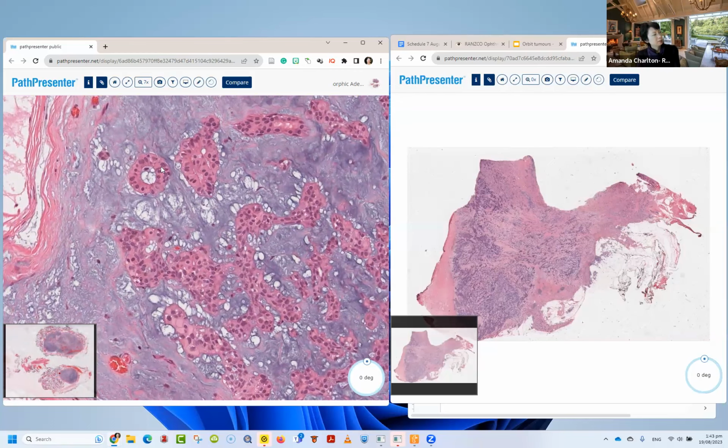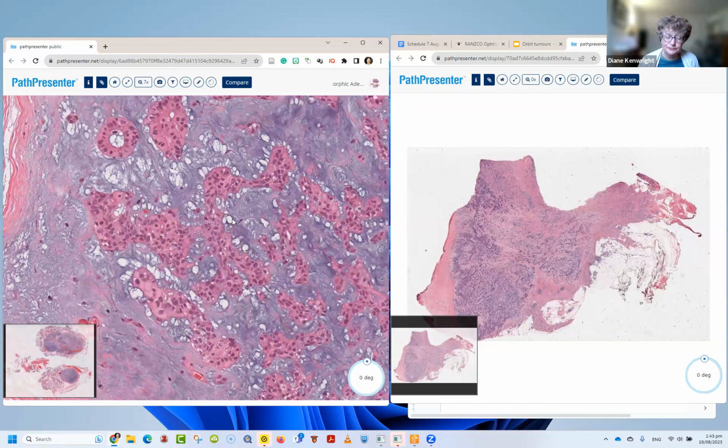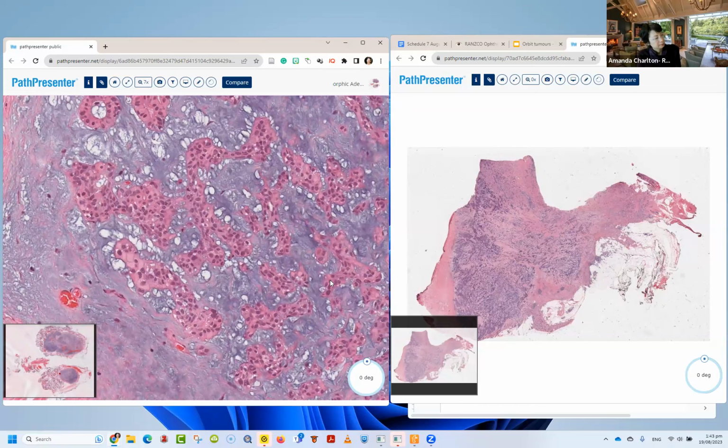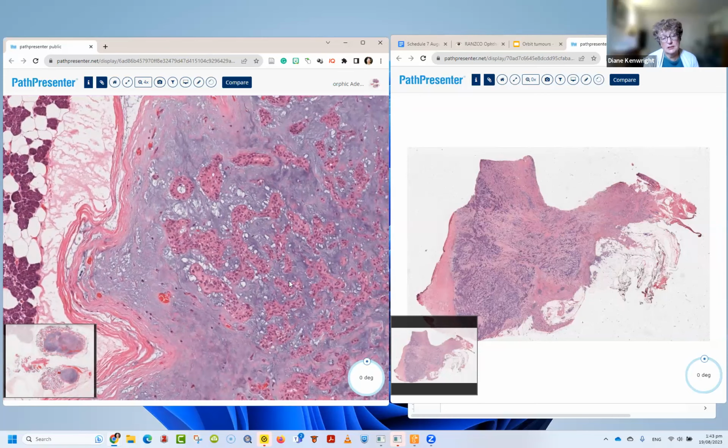Stroma and epithelial components. Yeah, so you can see there we've got the bluey stroma, which is actually very myxoid. So think kind of loose, a bit like snot, that kind of look. And then hyaluronic acid, that sort of thing. And then the ducts, which are round and lined by epithelial cells. Now, quite a few of these groups are solid, but that's mainly because they're mostly myoepithelial cells and they haven't formed many ducts.